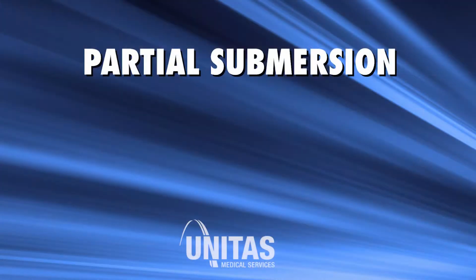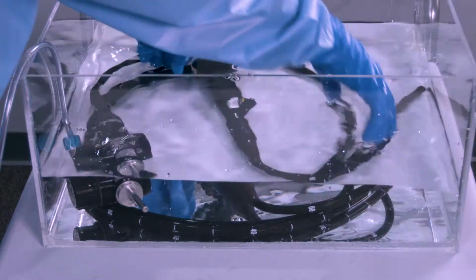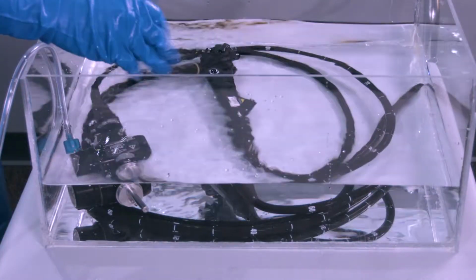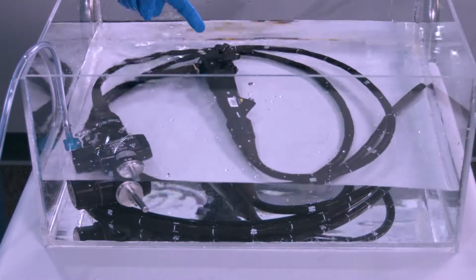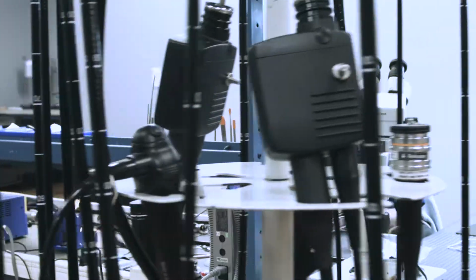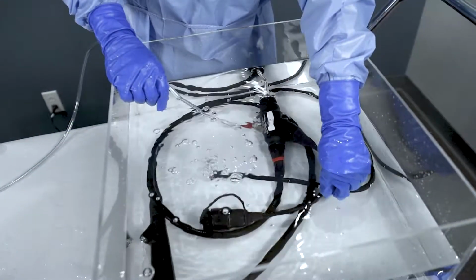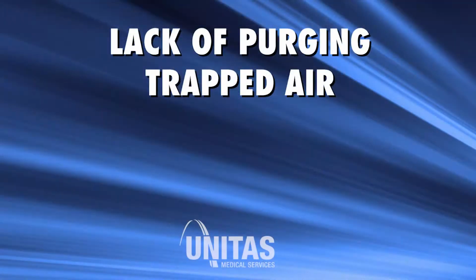Partial submersion. The entire endoscope must be submerged. Leaving the electrical end of the endoscope out of the sink, or the control knobs exposed, will not achieve a complete leak test. All current reusable flexible endoscopes, not to be confused with TEE probes, are designed to be completely immersed. They can leak from anywhere.